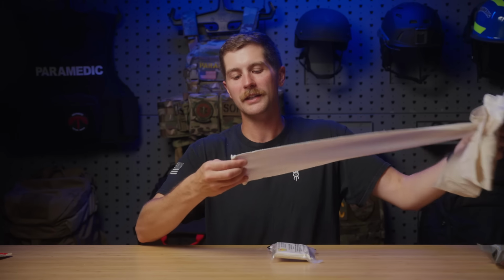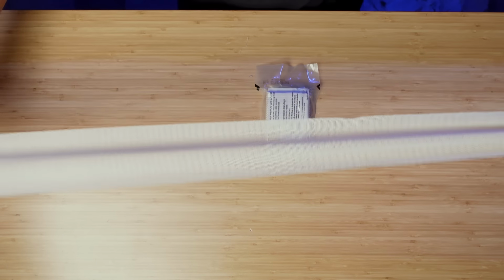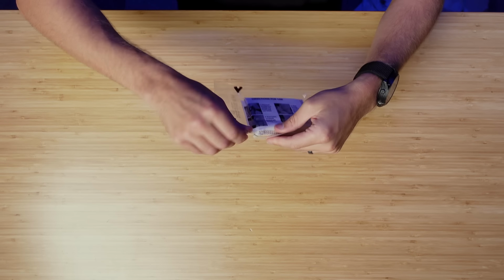So this guy here comes to the end and it will secure with a Velcro loop. Just make sure you're pulling these tight because this is a very elastic dressing. All right, last but not least in the H&H category, we have their mini compression bandage. Once again, I love these things because they're so compact, so easy to get into your stuff.